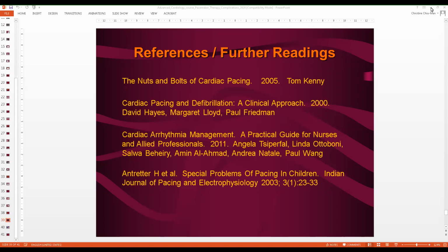Now, unfortunately, at this time, the company is phasing out that Micro Minny pacemaker, and they're coming out with a newer one. That newer one will not be as small as the Micro Minny. The Micro Minny is about the size of a slightly bigger toonie, and the regular pacemaker is probably double that size. So they're going to come up with something in between the Micro Minny and the regular size pacemaker, which is unfortunate because anything bigger than the Micro Minny will still be too big for these tiny, tiny newborns.